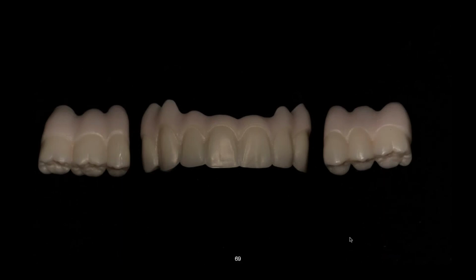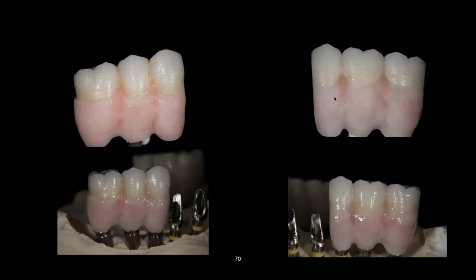So this is a white zirconia that was colored using the VITA liquids. And you can see the pink. It's not the best photo. You can see the pink for the tissue, and then of course the shade that we painted on here. And then this is the first bake with VM9 at the time. We break up in smaller pieces, and you can see the tissue porcelain.